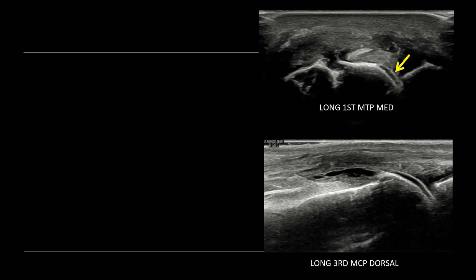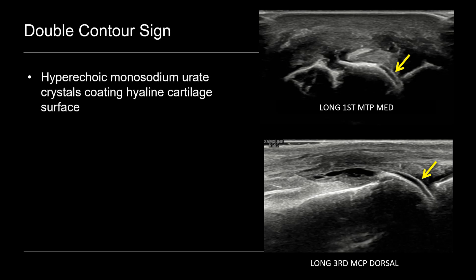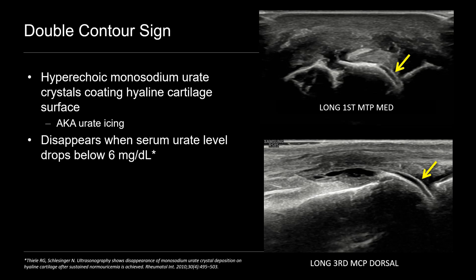Here's a different patient also with gout, involving the third metacarpophalangeal joint — the knuckle of the hand. There is a joint effusion with surrounding synovial hypertrophy, normal echogenic bony cortex of the metacarpal head, normal anechoic hyaline cartilage, but again this abnormal curvilinear echogenic line on the surface of the cartilage — the double contour sign. What's occurring is that monosodium urate crystals are coating the hyaline cartilage, giving it this hyperechoic appearance, also sometimes known as urate icing. This finding disappears when serum urate levels drop below 6 mg/dL. The first patient had a uric acid of 8.8 and the second had 8.0 — both above 6 mg/dL.